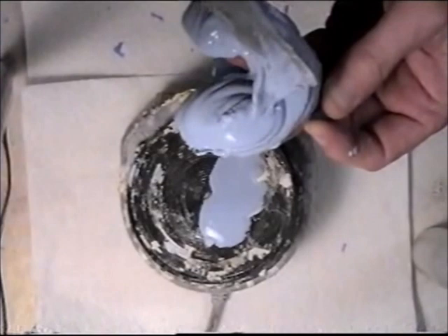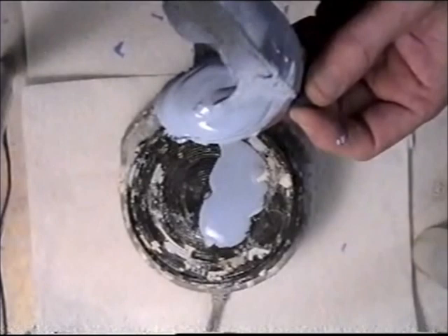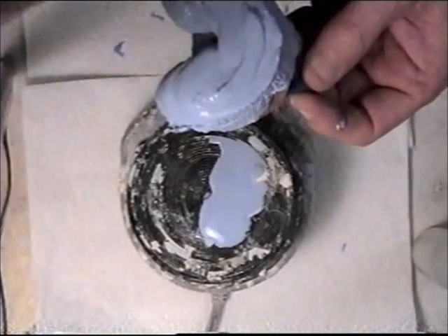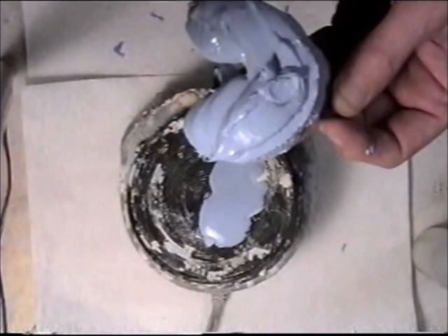We can trim this back now on a model trimmer when it does harden. But if they're exposed, then you're going to have a problem when you try to make the models, at least the type of models that I'm going to be making. I'm going to be making models that are glue articulated. They're going to be set in bases.